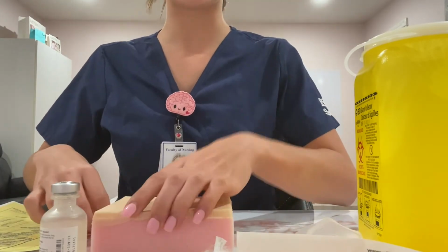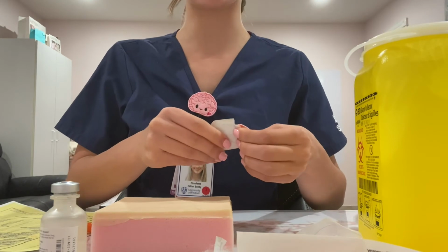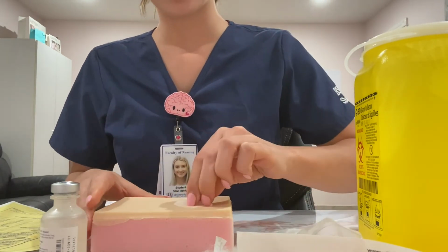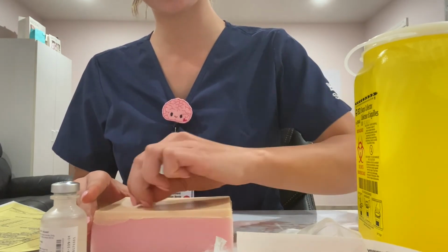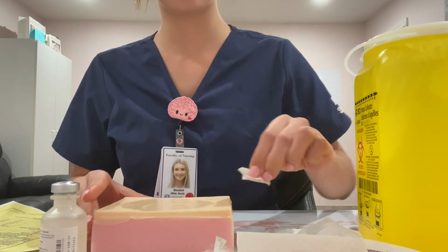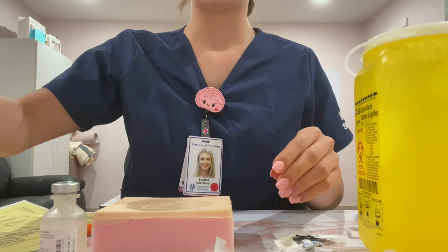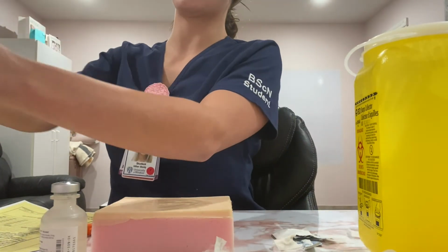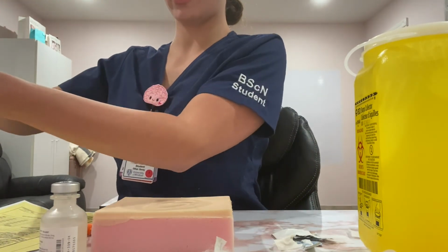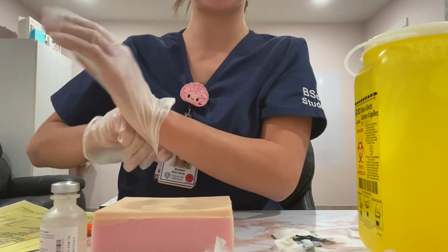So next I would take a swab at my site, and in this case I'm going to go 2 inches from the umbilicus and the abdomen area, and I'm going to swab. And I would have put my gloves on before injecting. Allow that area to dry.